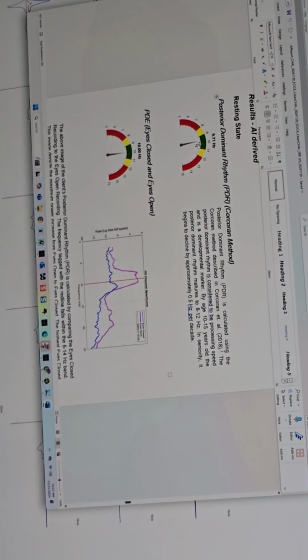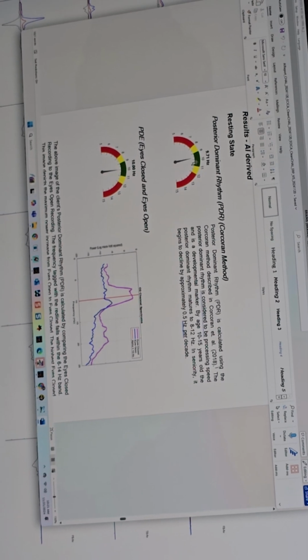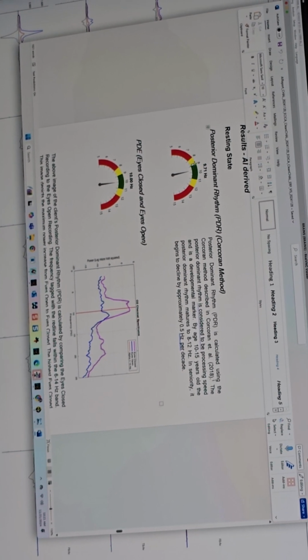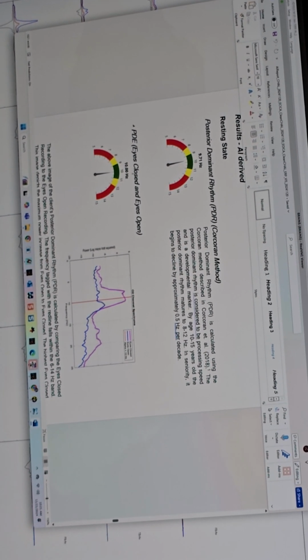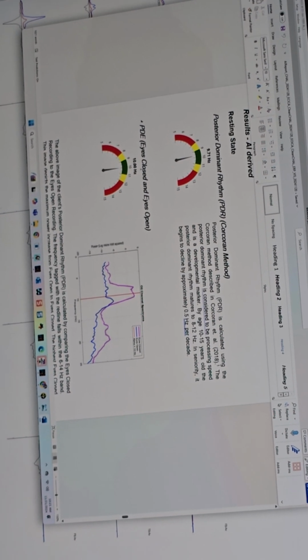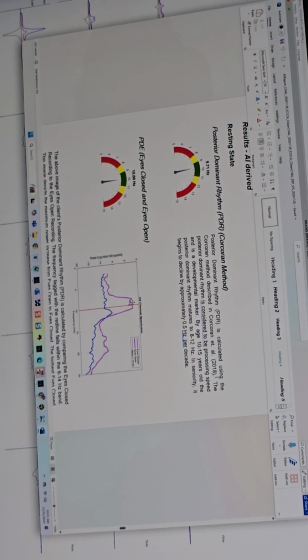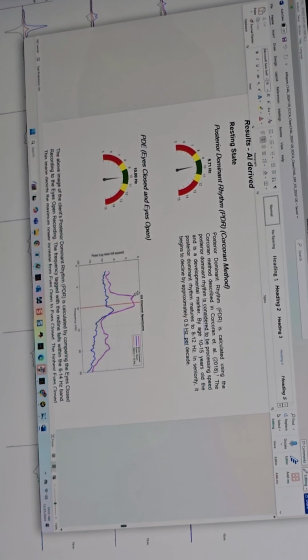Yesterday, it says your posterior dominant rhythm is close to a 10. Eyes closed. Yeah, it's close to a 10. That's good, that's kind of normal. That's healthy. And when you close your eyes, your alpha becomes a lot stronger. So that's a better response. And again, this isn't just the result of some caffeine. I don't believe that.